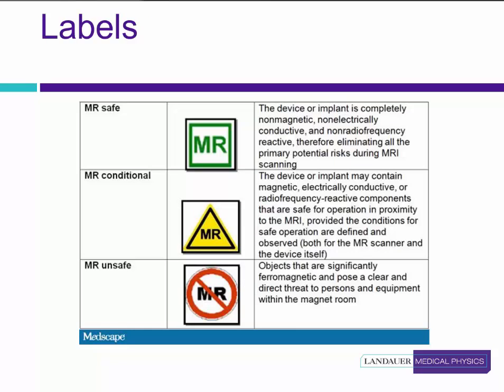MRI has existed as a clinical tool since the early 1980s, and in the past few decades there were numerous labels indicating MRI safety. To avoid confusion, standard labels have become popular over the past several years to clearly indicate the safety of various devices in the MRI environment. MRI Safe is the most restrictive of these labels and is a standard green text indicating it's okay to go into any MRI environment. For example, plastic screwdrivers, saline bags, and plastic wheelchairs are generally cleared as MRI safe.